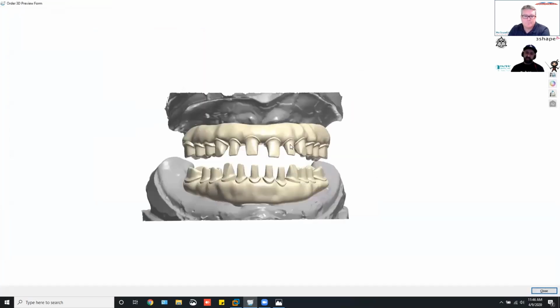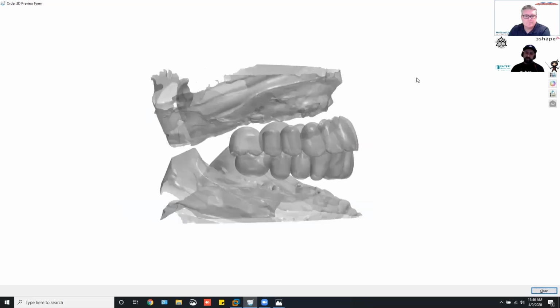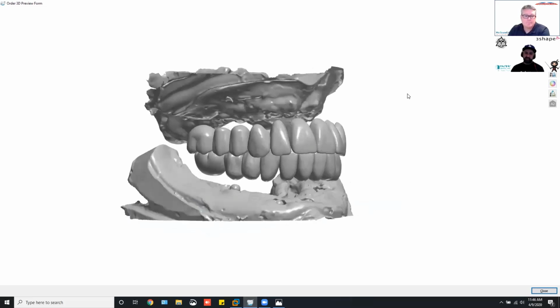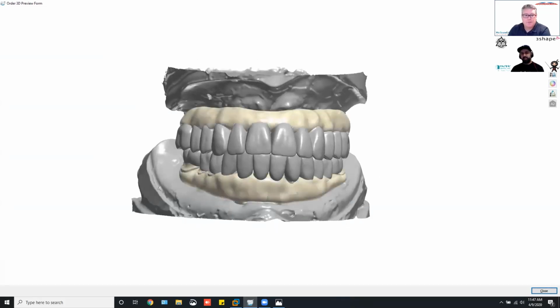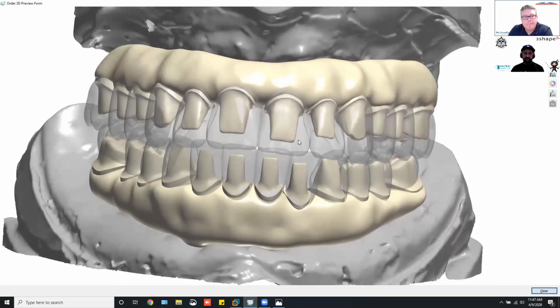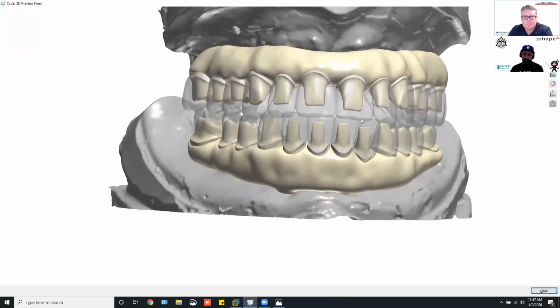For designing, how did I get to this point? Well, I had a pre-op, and my pre-op was actually a virtual wax up. To show this is the actual design of the other case. I just made a virtual wax up of this, and with that we can design bridges like this, a Toronto thimble bridge. With cases like this, how are you going to manufacture this? So I just say mill it to the best you can, clean it up, and then rescan it, and then do the teeth over it.